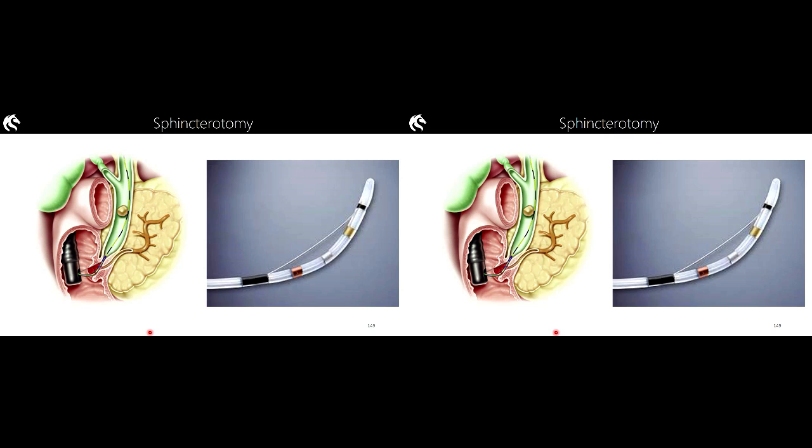And for that, we undertake a sphincterotomy. A sphincterotomy is the process of cutting the sphincter of Oddi larger. The sphincter will start out, magnified view, being an approximately round structure, and by the time we're finished with it, it's going to be a big teardrop-shaped hole. Here goes.